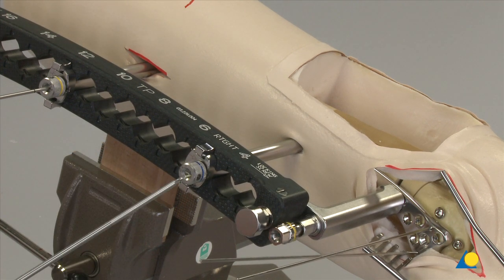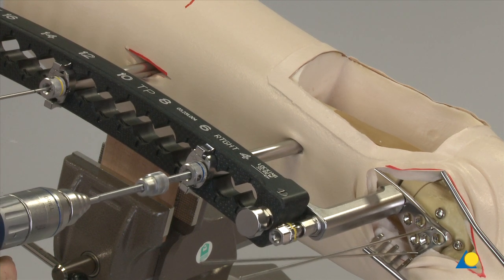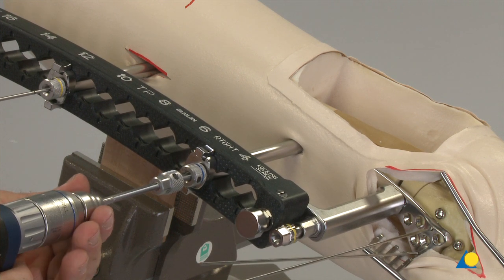Insert the pull reduction device through the drill guide. Ensure the nut sits high enough not to interfere with the insertion. Stop insertion before the tip reaches the far cortex.